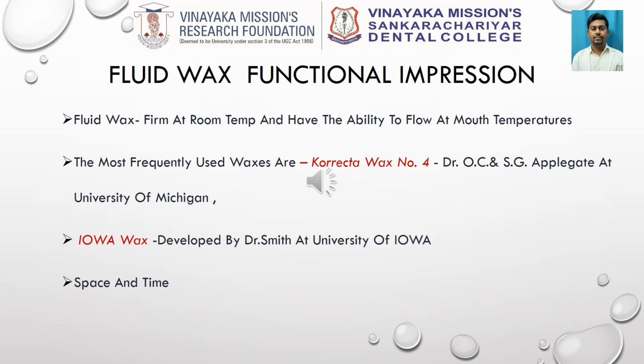The space refers to the amount of relief provided between the impression tray and the edentulous ridge. The impression wax flows very sluggishly, and a thin layer of wax will flow less readily than a thicker layer. So 1 to 2 millimeters of space is very essential, and each time the tray is introduced inside the mouth, it must remain in the oral cavity for a minimum of 5 to 7 minutes.